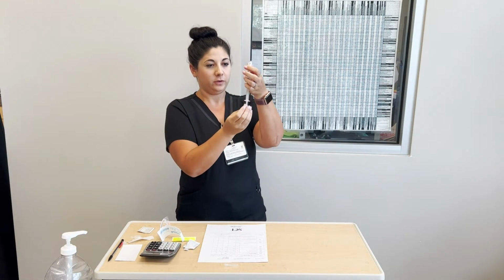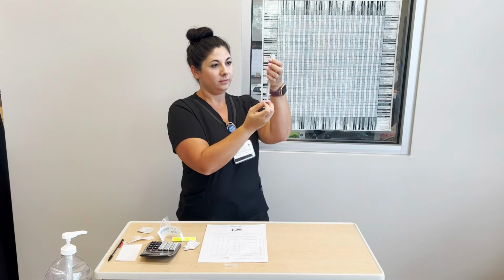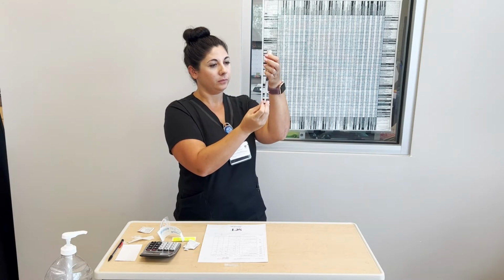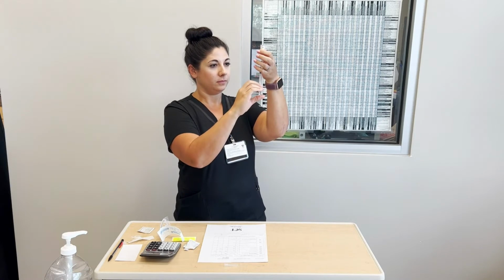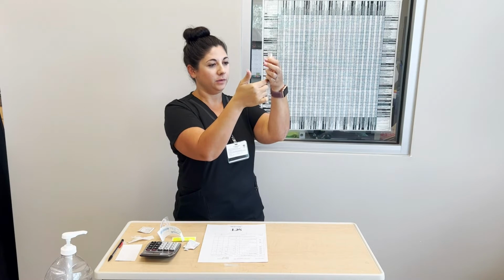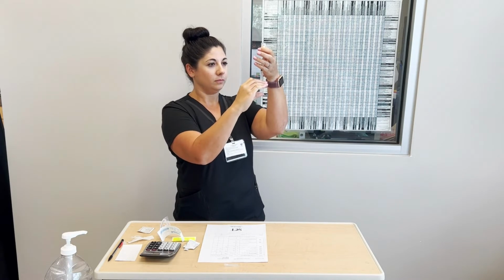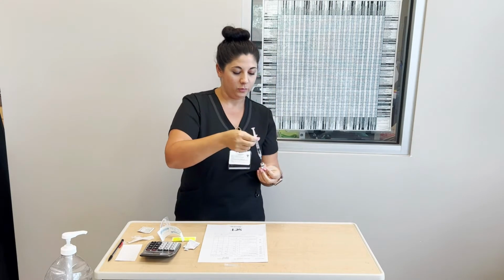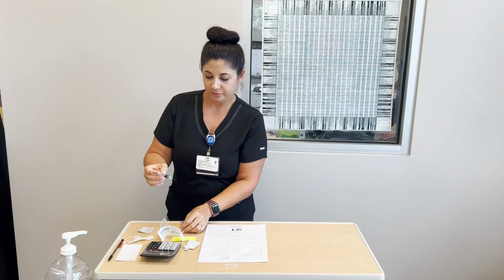And flipping it over, making sure not to touch the barrel. And get all of those little air bubbles out. I have 1 milliliter of medication.